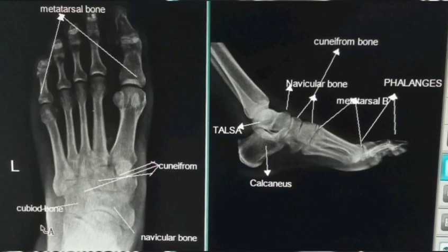This is the first of two videos in which I will be discussing foot x-rays as part of the Grand Rounds Intern Radiology Lecture Series. The objective of the online portion of this lecture is to familiarize you with the basic anatomy and interpretation of the normal foot x-ray. In this first video, I'll be discussing basic anatomy, including the bones and joints of the foot. In the second video, I will be reviewing a basic approach to x-rays, orienting you to the classic views of foot x-rays, as well as discussing how to interpret these films. During Grand Rounds, I will be applying these skills to several case reports.